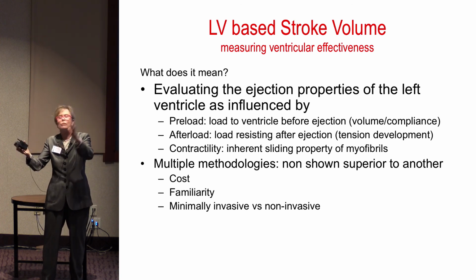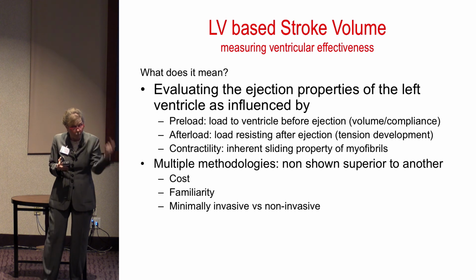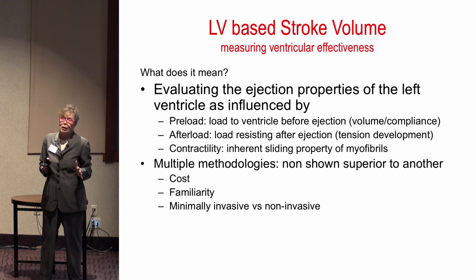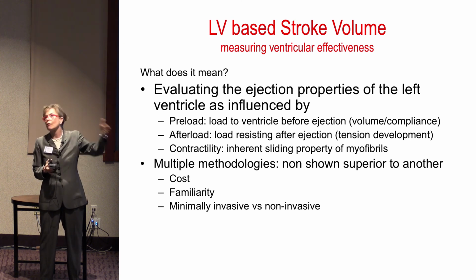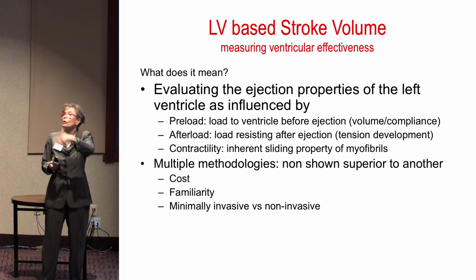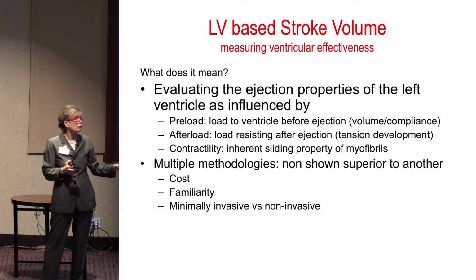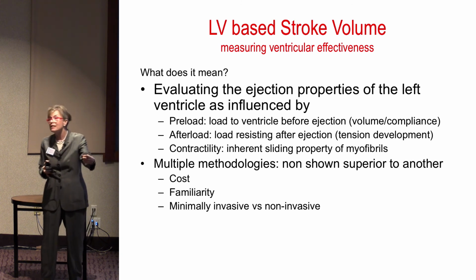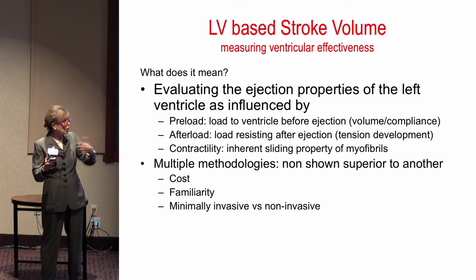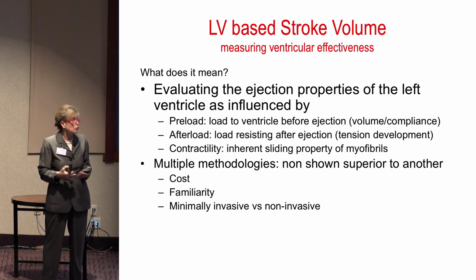Now, are there other problems? Yes, of course. But it is really important to consider that. So I do want to tell you and remind you that in general, when we look at methodologies to look at LV stroke volume, there is no pure superiority study. All our methodologies are non-inferior. So comparative analysis has not come to any point to say this is the superior way to look at LV stroke volume. A lot of it depends on what your value analysis has encouraged. It depends on what the comfort level is of our staff and our colleagues and what it is we're using at the bedside, but we don't have one methodology that's superior to another.